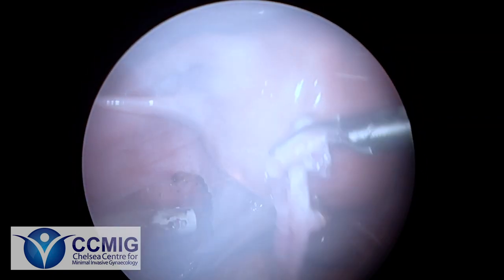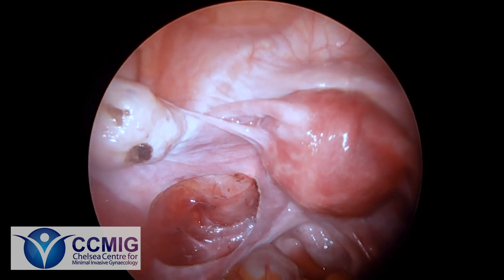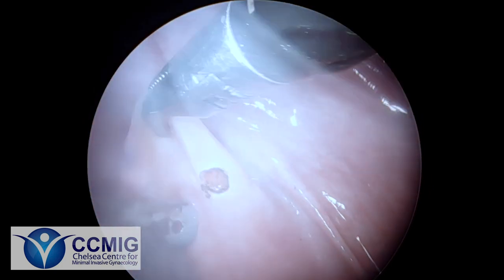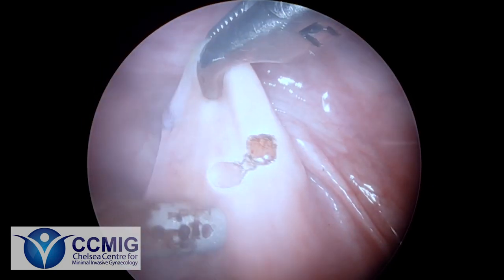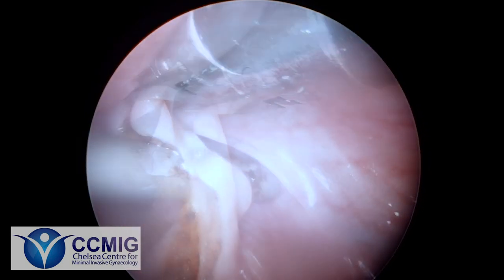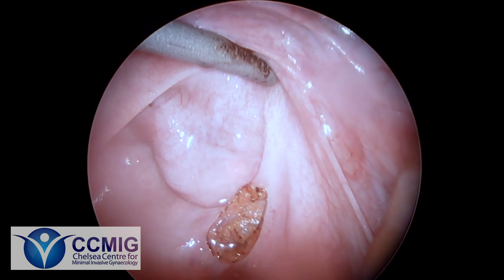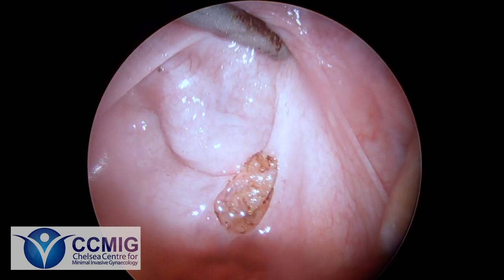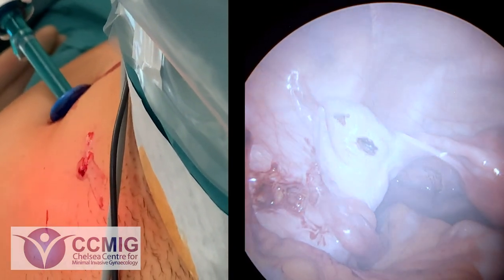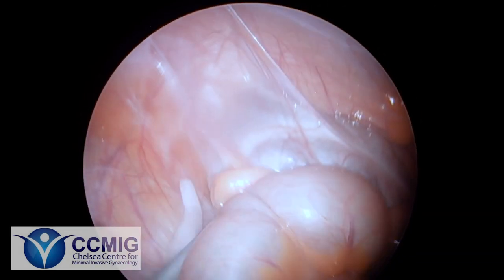So here we are having removed this patch. You can see a large area where the peritoneum has been removed. It looks fairly dramatic but actually this peritoneum is going to grow back really quickly and the hope is all this normal healthy peritoneum will occupy that space where the endometriosis once was. Now it's time to excise the other patch of endometriosis we saw deep in the pelvis — and we can see there a normal patch of healthy tissue which will regrow and occupy that space. That was all the endometriosis we saw on this side, so we can free the ovary now to fall back into place quite happily.